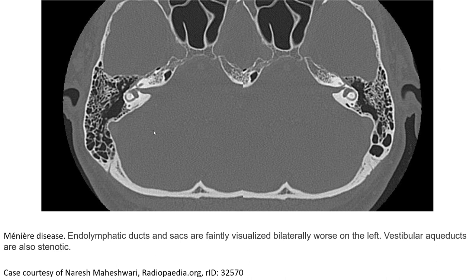This is another case of Meniere's disease. The endolymphatic duct and sac are poorly visualized bilaterally, worse on the left. The vestibular aqueducts are also stenotic.